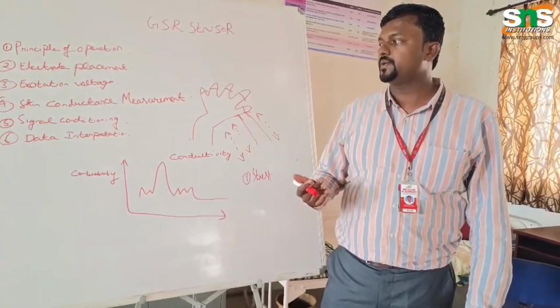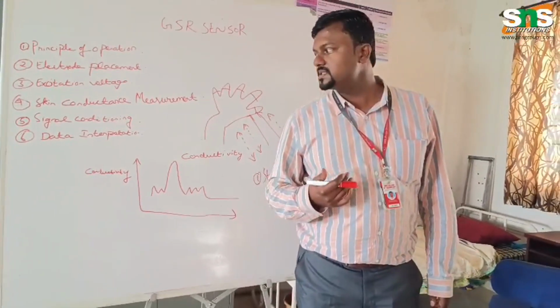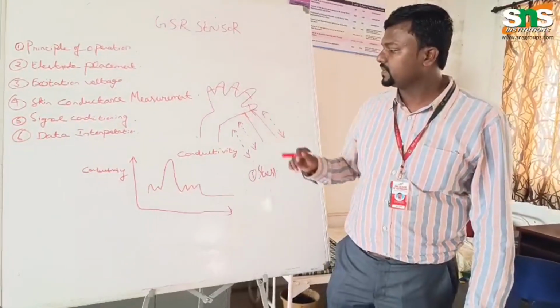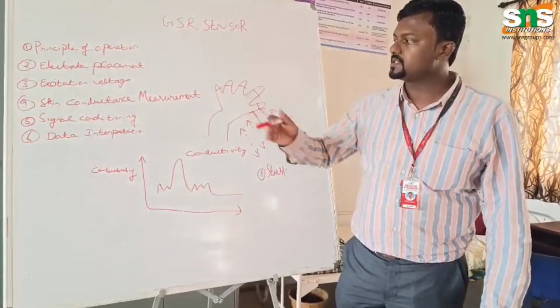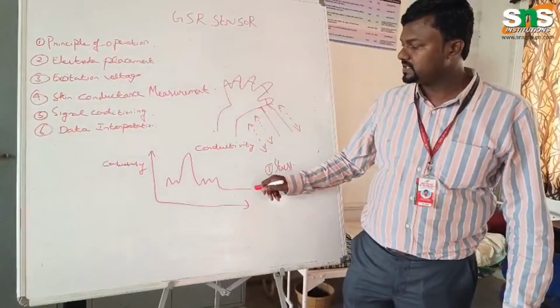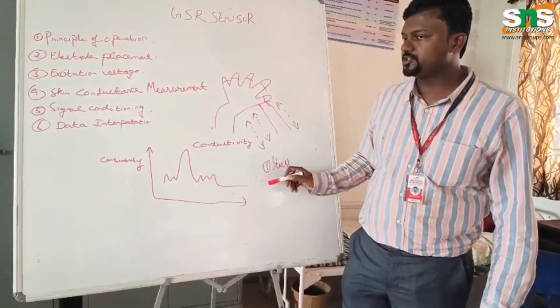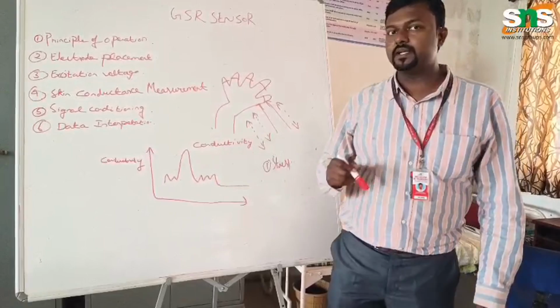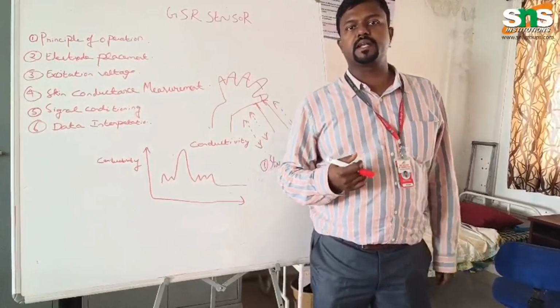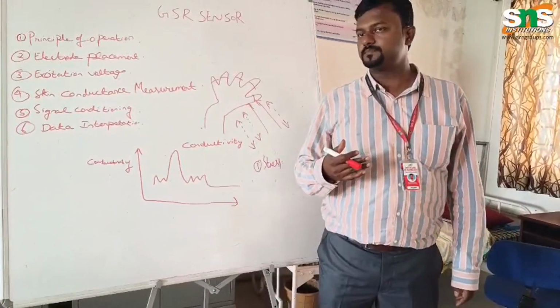This data interpretation plays a very important, vital role, because whatever data is collected from the electrodes goes through some signal processing units, and then the graph is displayed. Based on this graph, where the peak point is high, where it is low, and where small variations occur, these things are studied by the doctor. Then he prescribes the medicine according to the condition of the patient.